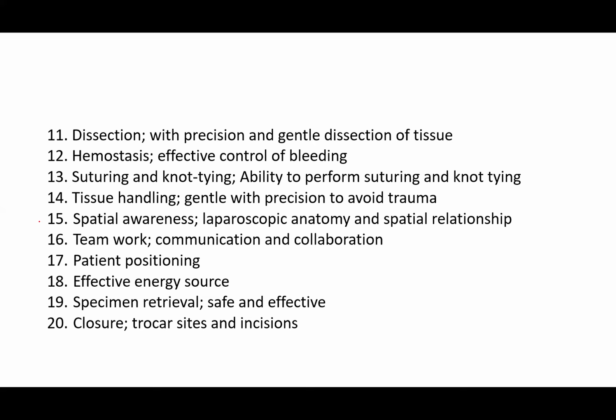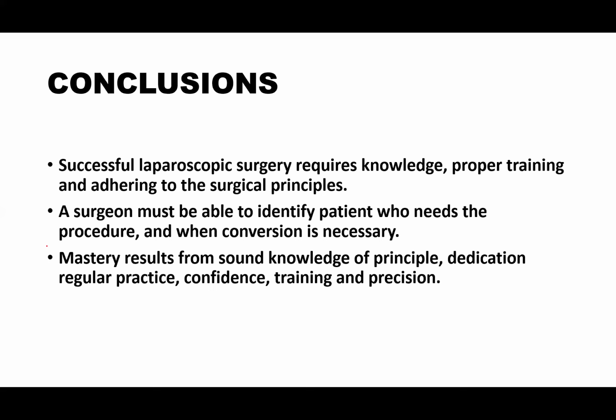If they are infected specimens, you have a tendency of having a port site infection. If they are specimens with suspected malignancy, you might seed the tract, the port site. Now, closure of trocar sites and the incision. Those are the basic principles of laparoscopic surgery.